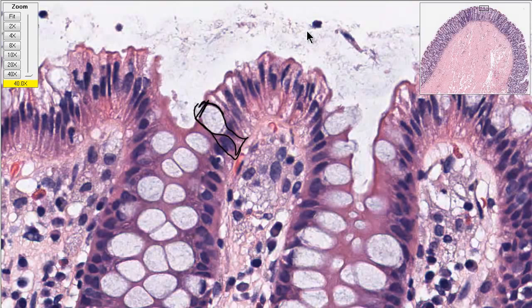So you're going to absorb a lot of the water through these cells here. Just to be clear, I'll do this in blue. The mucin would come out here, and then the water would be absorbed by these cells that don't have the mucin part, right over there. Yes, that's exactly right. So the 2 main functions of the colon are right there with those 2 cells.